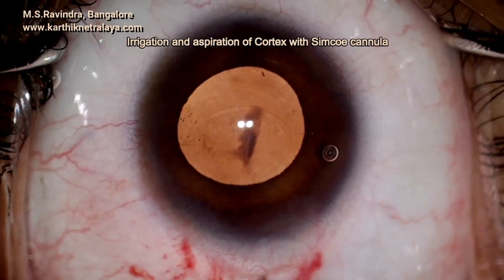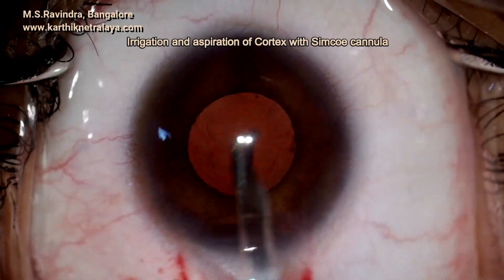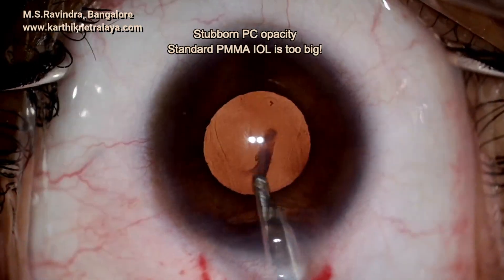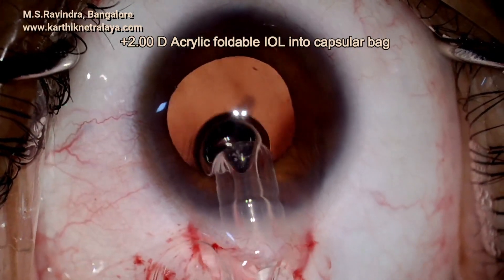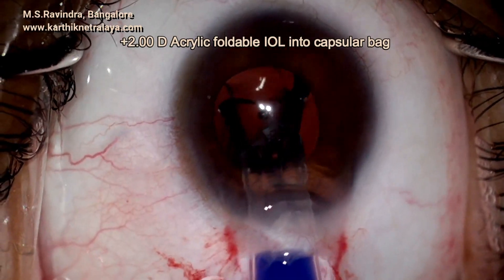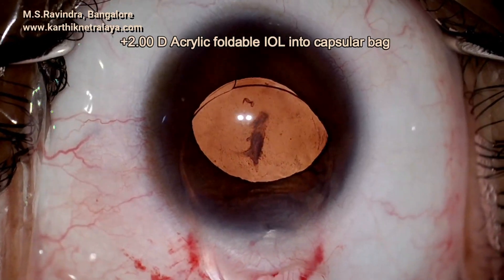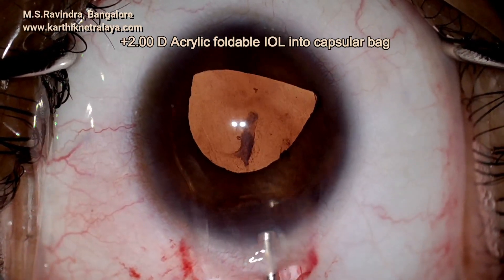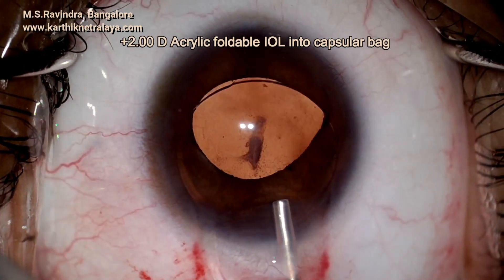Any residual cortex is aspirated and any amount of attempts to remove the posterior capsule opacity did not succeed. A PMMA lens of standard size was tried but it was too big, so that is abandoned and we are going to implant a flexible foldable acrylic IOL, which is injected into the capsular bag. Being a flexible foldable lens, it can be easily implanted and maneuvered into the capsular bag.